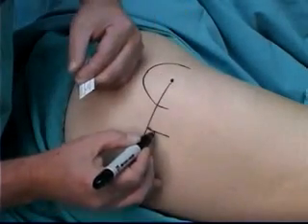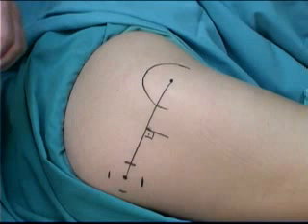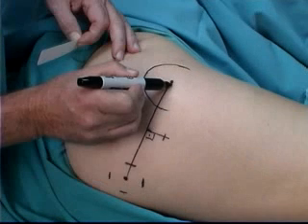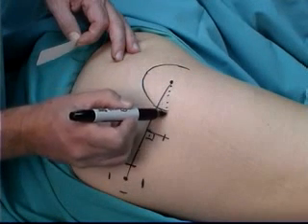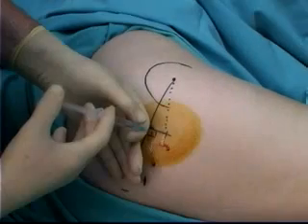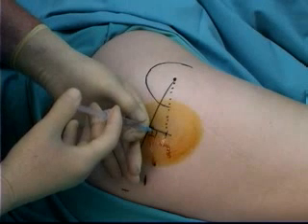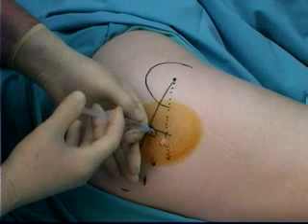Now draw a midline perpendicular to this line. This line indicates the position of the sciatic nerve, and the dotted line indicates the intended path of the catheter should a catheter be indicated. After disinfecting the skin, the skin and subcutaneous tissues are infiltrated with local anesthetic agent.